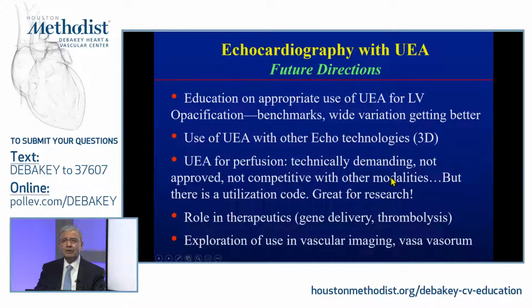but certainly we encourage our colleagues to venture there and use it, particularly our vascular ultrasound specialists and surgeons who use that technology a little more than we do. So with that, I'm going to stop here and take some of your questions.